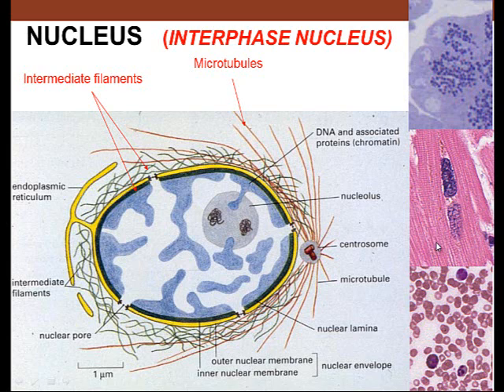This is a cardiac muscle cell, and you see the cytoplasm in through here. Most of what we're seeing here are the myofibrils, little cross sections of the actin and myosin components. That's the pink. And then we see the nucleus.